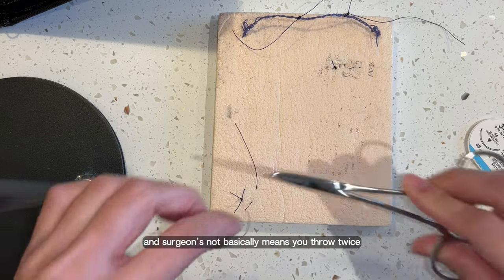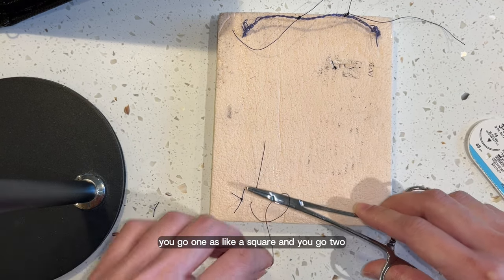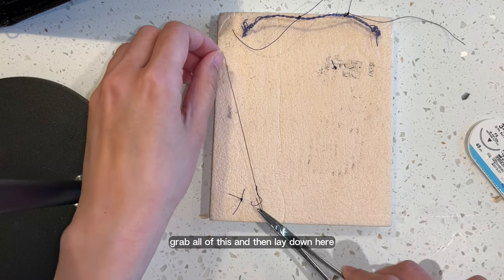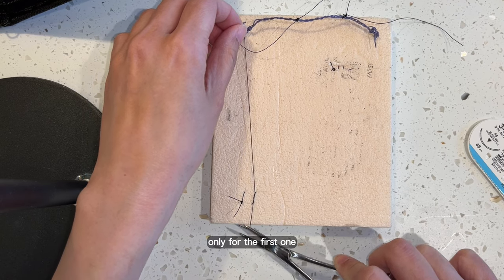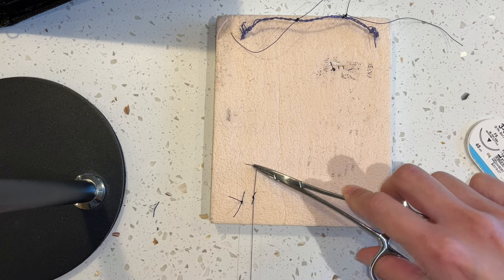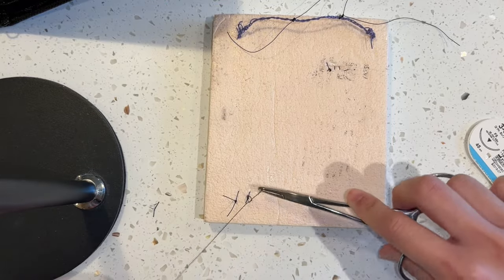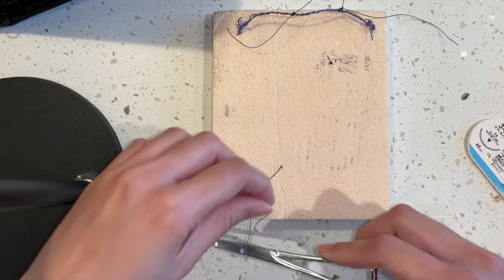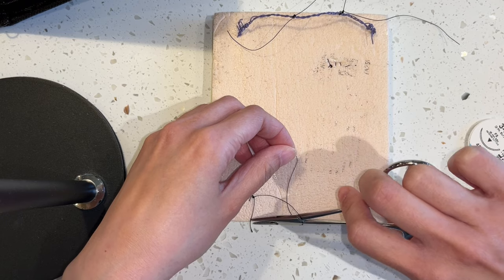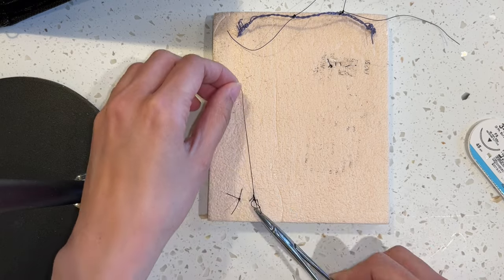Surgeon's knot basically means you throw twice. So you go one — that's like a square — and you go two. That's it, surgeon's knot. Grab hold of this and then lay it down here, but only for the first one. The second one, you just do one throw like this. And you continue again. You can keep going as well until you get the hang of it.